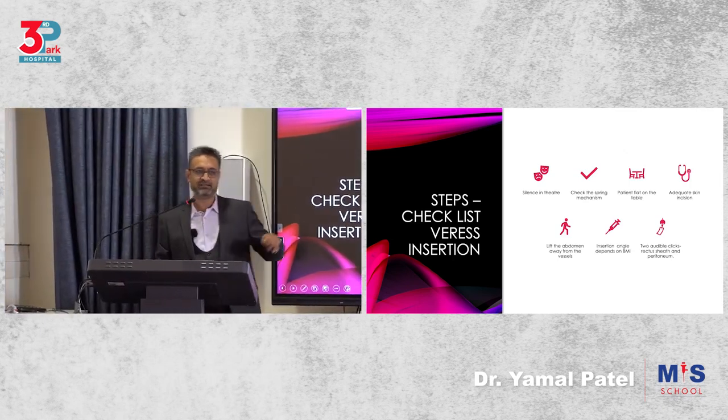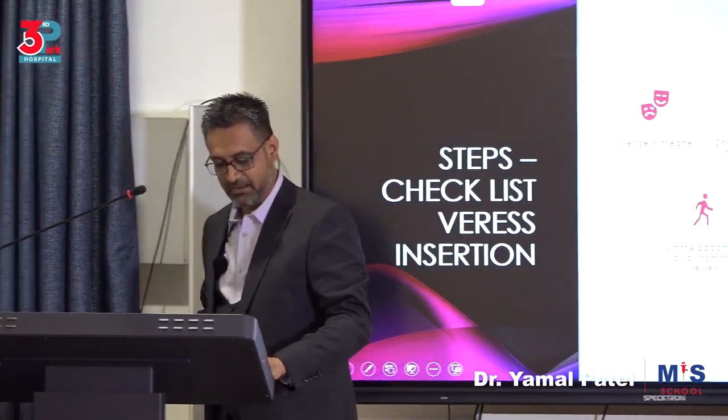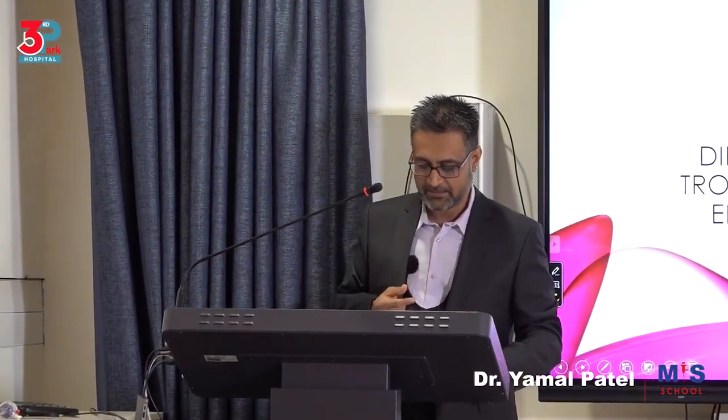What do you do after that? Start rotating around? No, please never do that. If you have gone into a vessel like this, it's like a needle, nothing will happen, or bowel. But when you do that and now you rotate, you're making that small hole into a laceration. And now you have a problem. So you do your safety tests with saline and so on, but without moving around. So safety tests, very important.